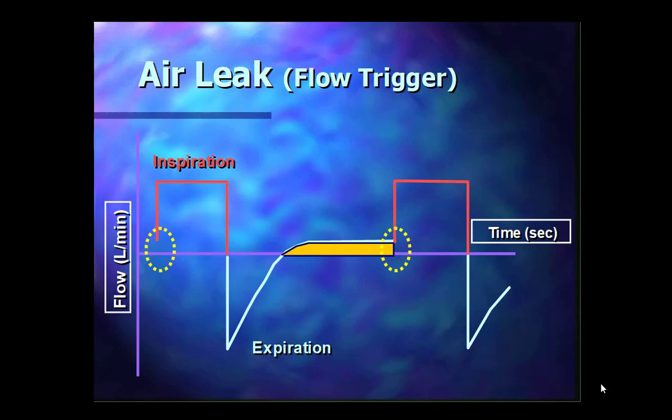Now air leak, what's happening? So you can see air leak here, it's inspiration, exhalation, and the exhalation is going towards the positive. What does this mean? Some amount of volume is getting lost on the inspiratory aspect. That's the reason why it is crossing the baseline. And this is where the importance of flow towards and flow away becomes important. Right? So, where is your flow sensed? You tell me, in your ventilator.